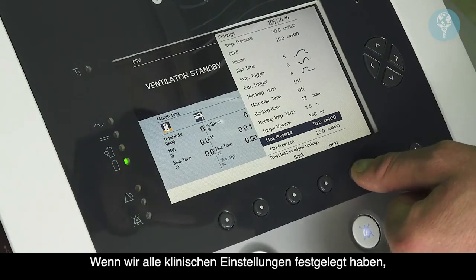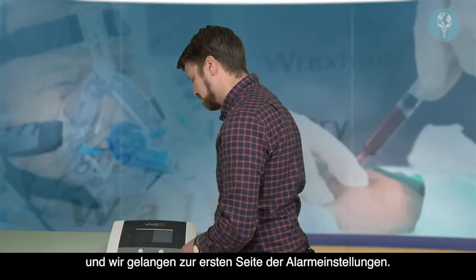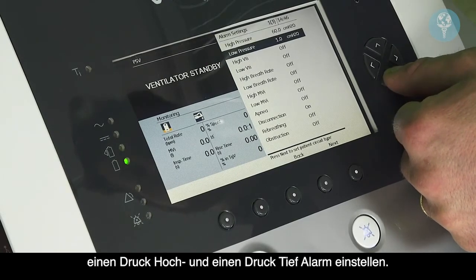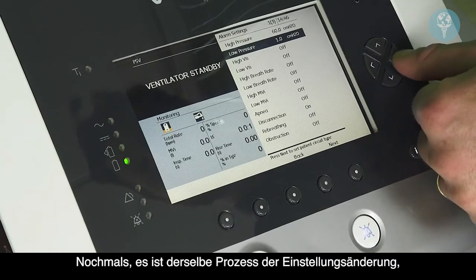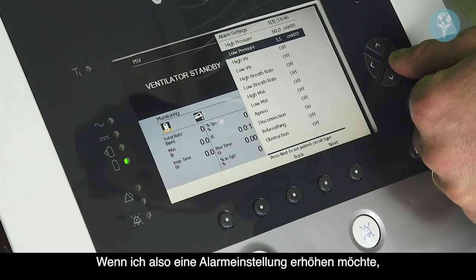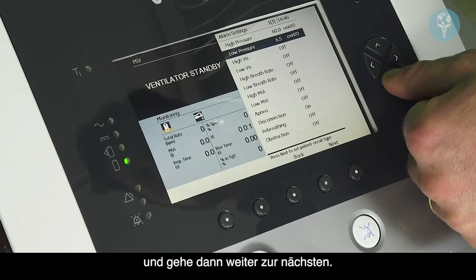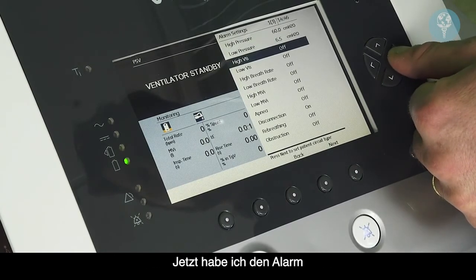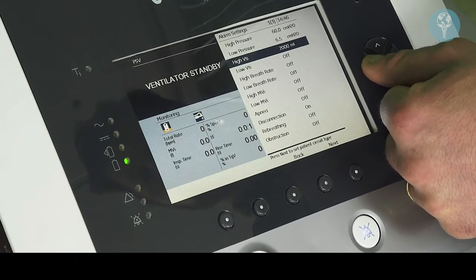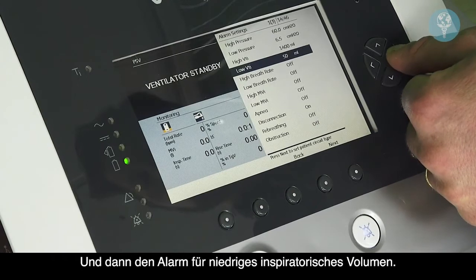Once we've set all of our clinical settings, we then press next, and you'll see then we go through to the first page of the alarm settings. Once we're in the alarm settings, we can set our high pressure and low pressure alarms. Again, it's the same process of changing the settings as we've just seen in the settings menu. So if I want to increase a pressure setting, I'll just do so with my left and right buttons, and then I move down to the next one. Okay, so now I have my high inspiratory volume alarm. Okay, and then my low inspiratory volume alarm.